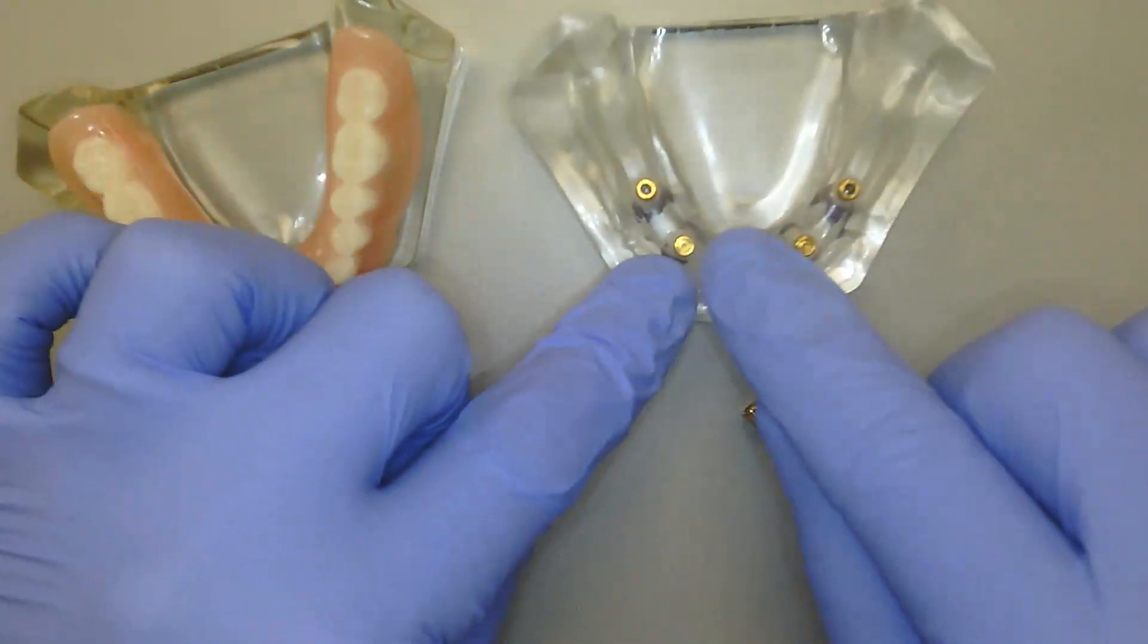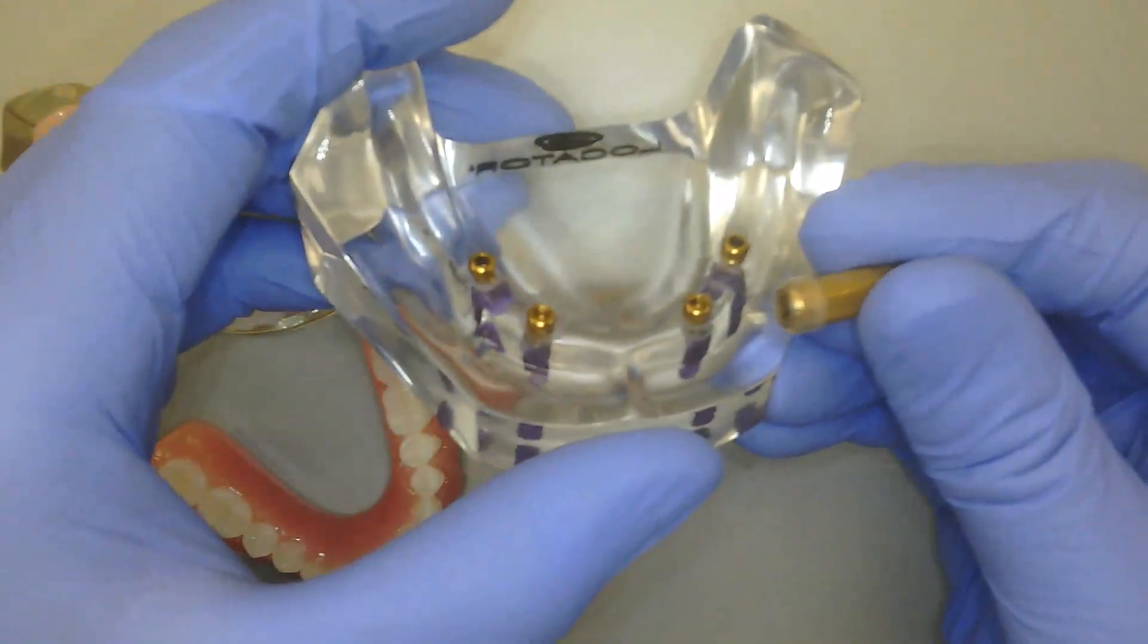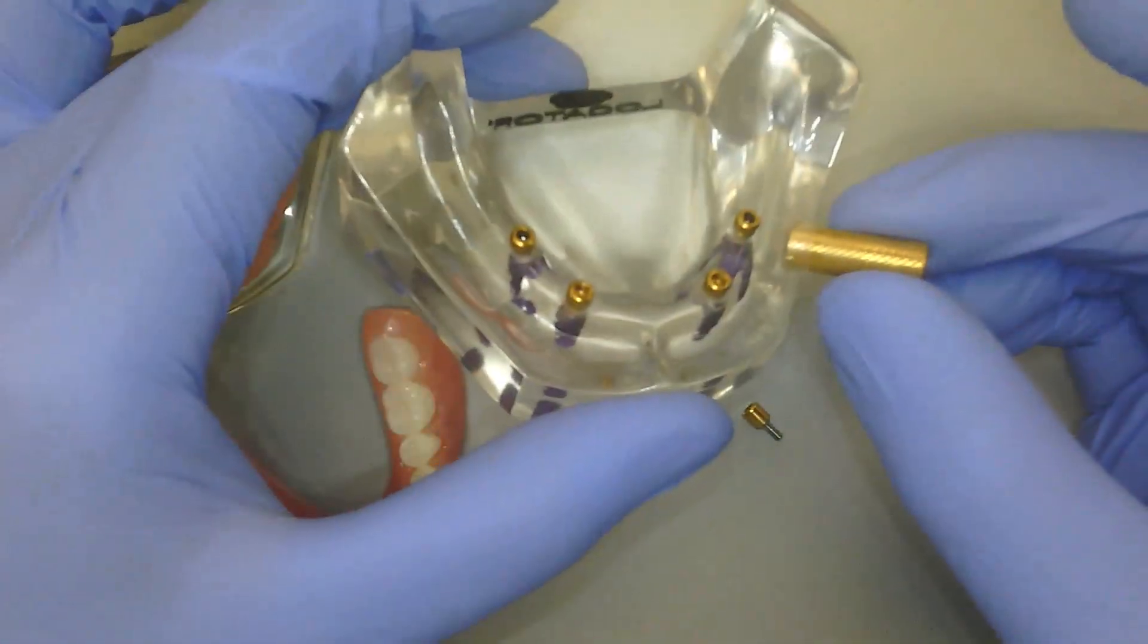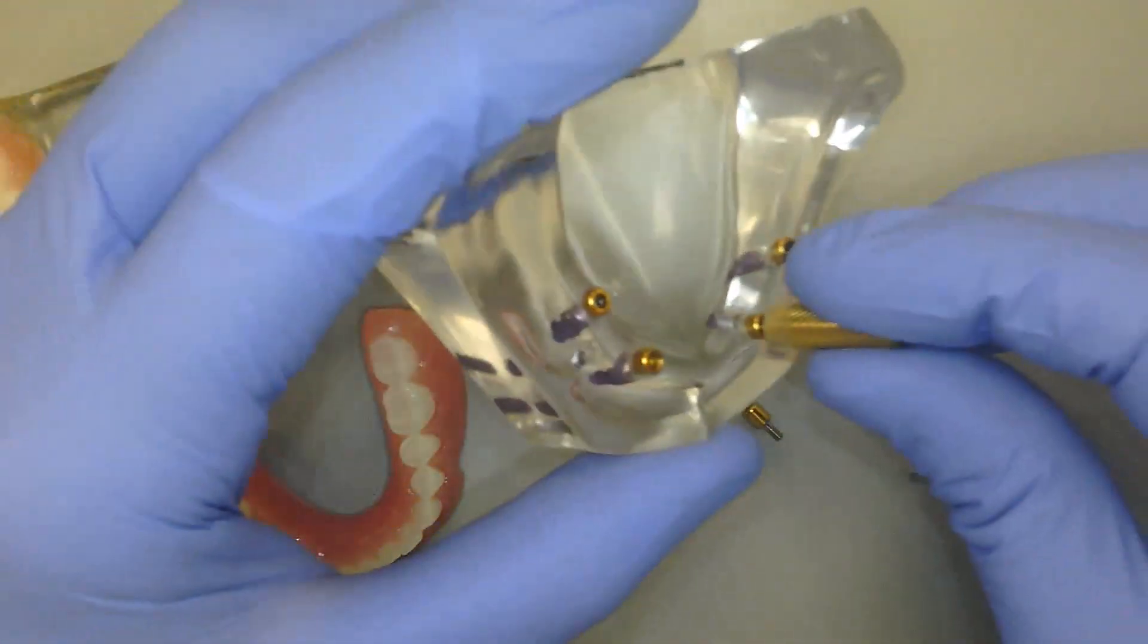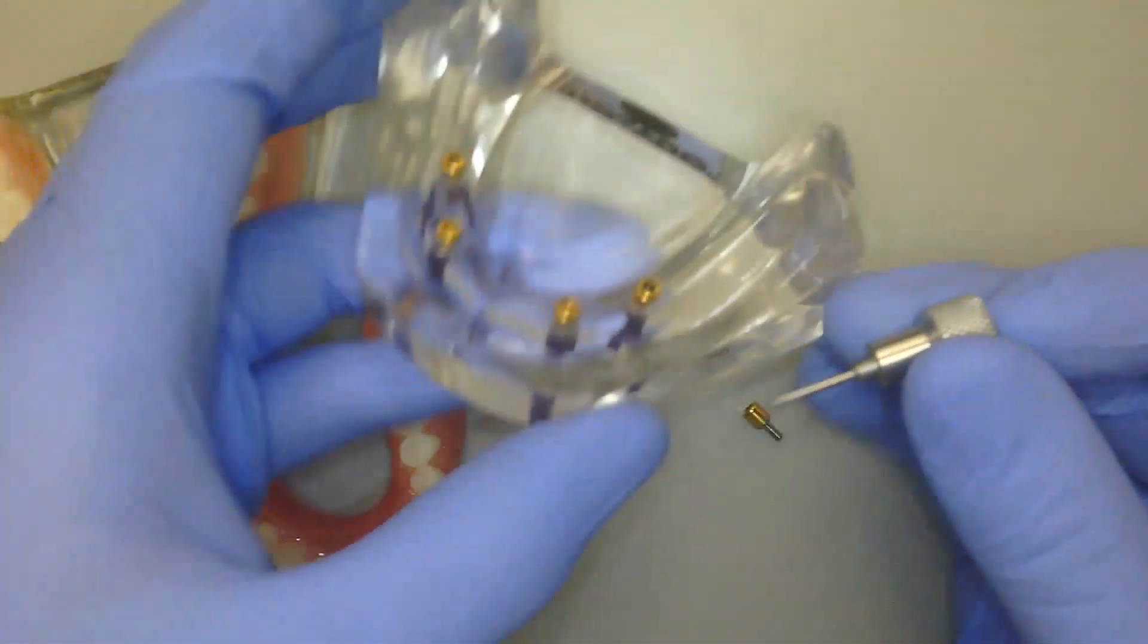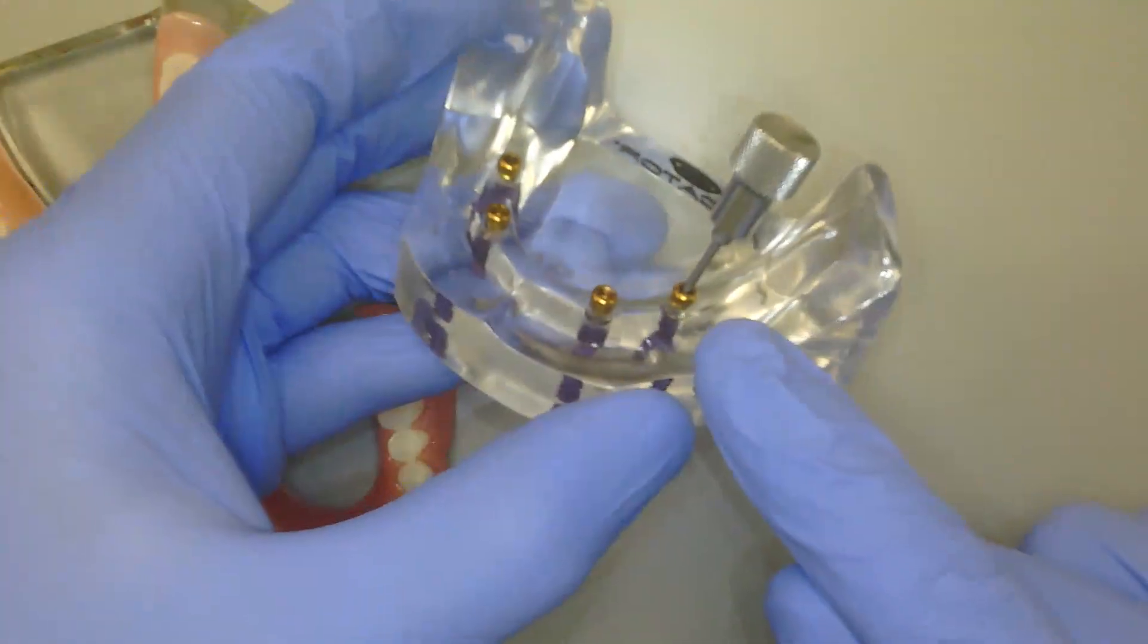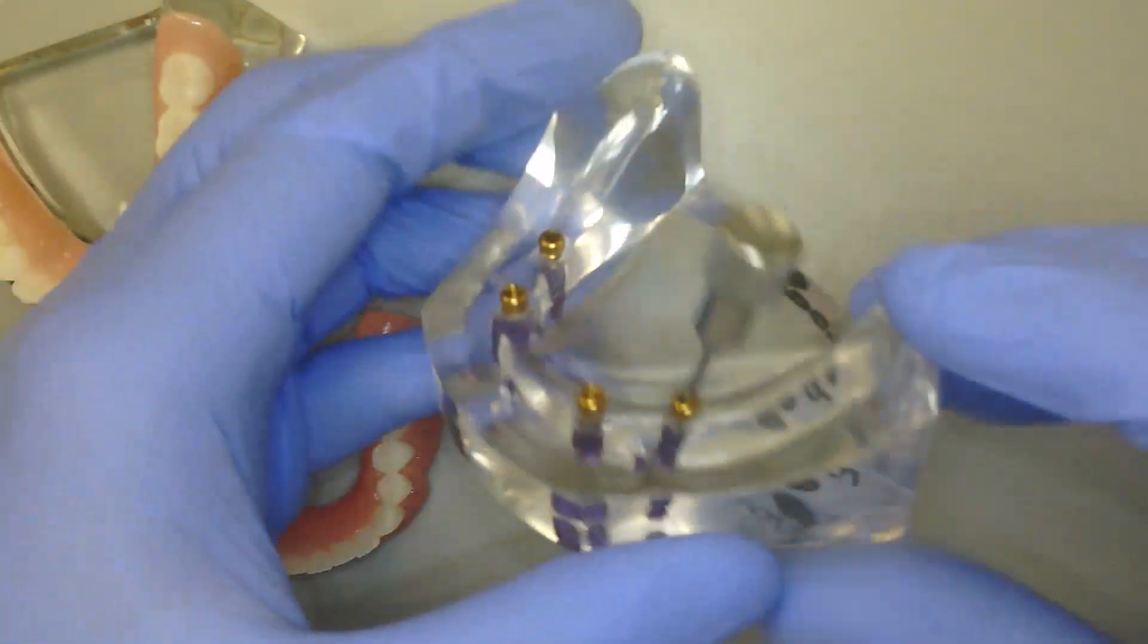Now at this point, we can place our standard locator abutments utilizing our locator core tool or our manual driver to place our locator abutments. With our locator angled, we are going to be using a hex driver to tighten those down and to place our abutments in that orientation and angle.